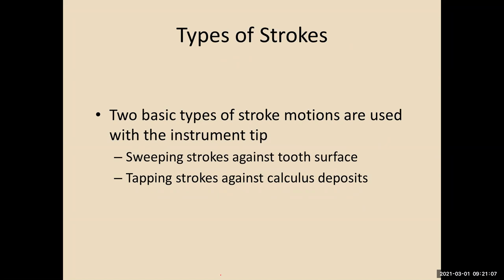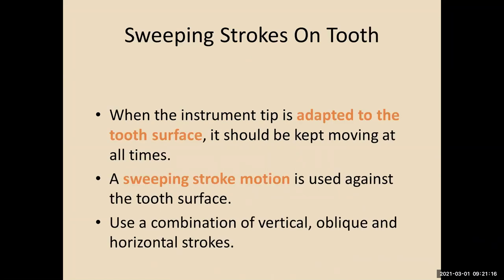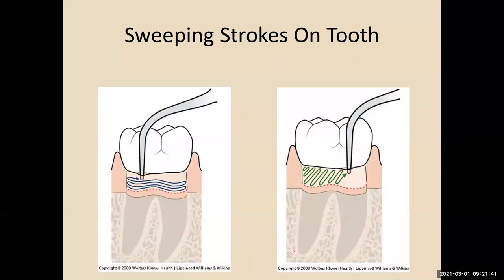Let's take a look at strokes, sweeping strokes or tapping strokes. What do you want to use? When the instrument tip is adapted to the tooth surface, it should be kept moving at all times. Remember that vibration is creating heat. That heat is being transmitted to the tooth. So the sweeping vibration motion against the tooth surface is what you're looking for. And it's a combination of vertical, oblique, and horizontal strokes, just like your hand instruments. But you're using slow movement and you're trying to cover the entire surface of the sulcus or pocket area.